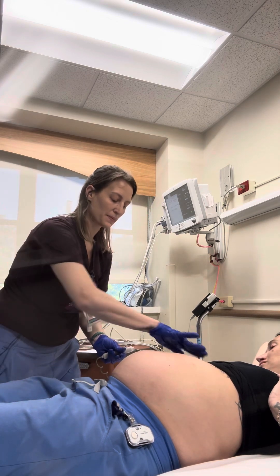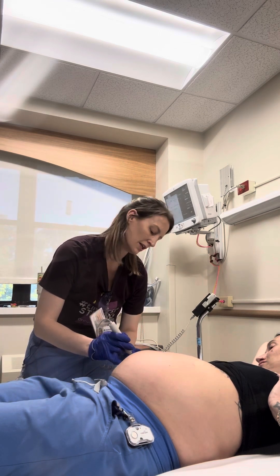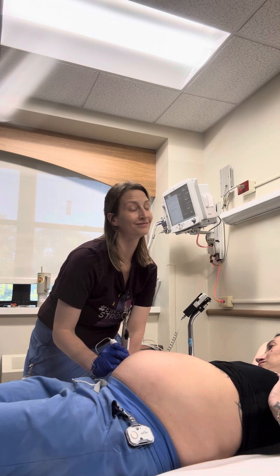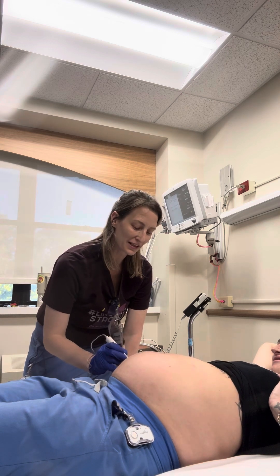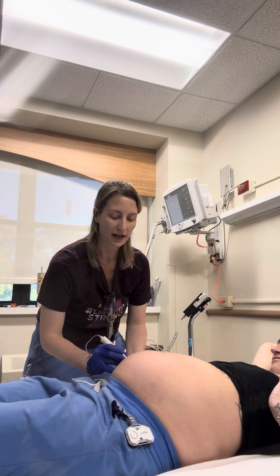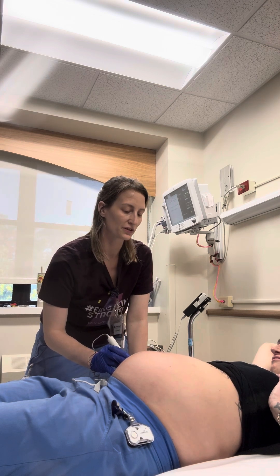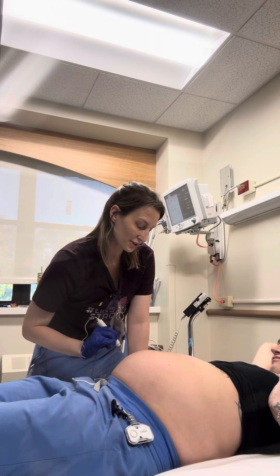Since your baby's back is along the right side, we should be picking up fetal heart tones right above the right shoulder blade — that should be on the front part of your abdomen. With a real fetal Doppler, I'd be picking up fetal heart tones about right here, over the baby's right anterior shoulder. We'd be listening for about a minute for variability, including when the baby's moving, and also for regularity to make sure the heart rhythm was regular.